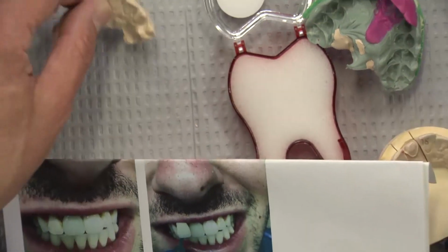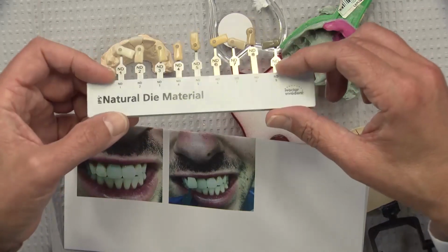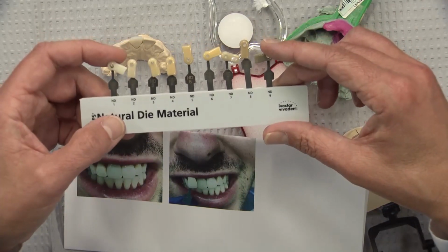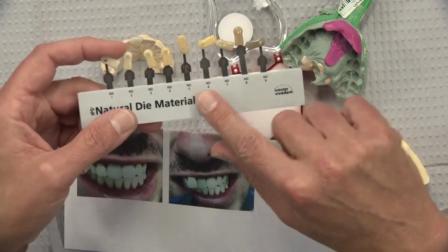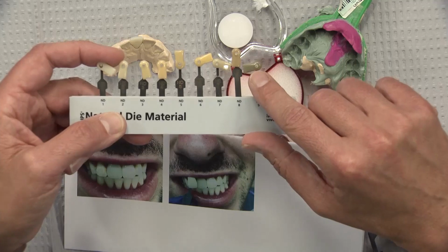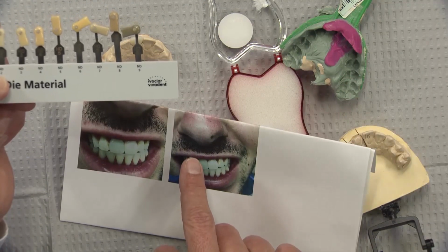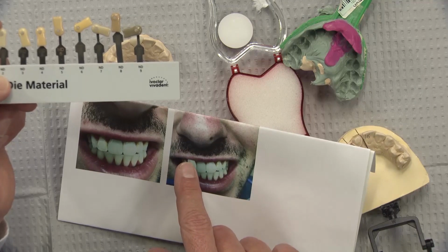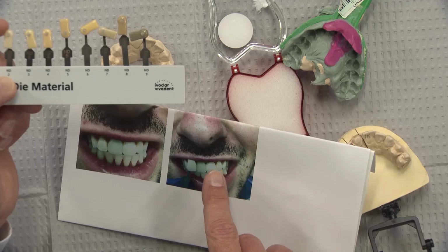If you're going to be doing these more translucent restorations, it is really helpful to have the natural die shade guides in there, and let your lab know if you're down in the 5 to 9 region. And certainly take a picture, just like you would with the A1 shade tab in place, saying here, we want to match this. See, here's the A1. I would have liked to see the shade tab over here next to number 9, if that's what we're trying to match, so they can see number 9.